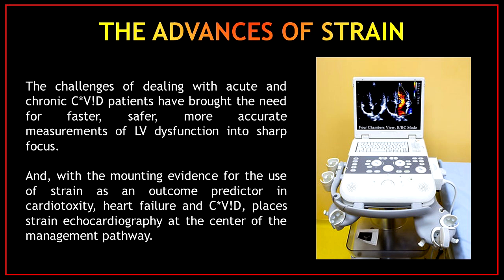Now let's talk about the advances of strain. The challenges of dealing with acute and chronic patients of this virus have brought the need for faster, safer, and more accurate measurements of left ventricular dysfunction into sharp focus. And with the mounting evidence for the use of strain as an outcome predictor in cardiotoxicity, heart failure, and patients with this virus, strain echocardiography is placed at the center of the management pathway.